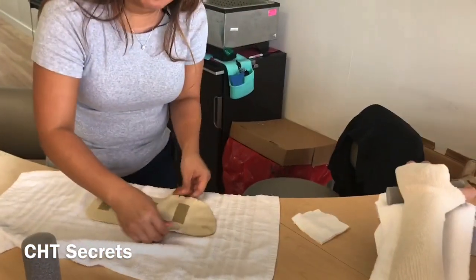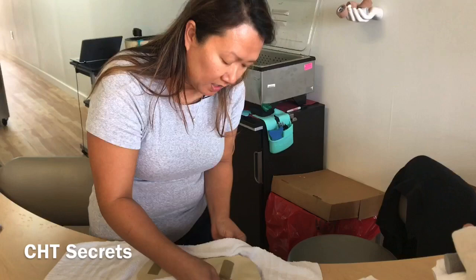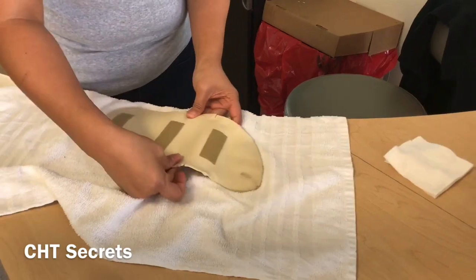This is what happens when you have to recreate a splint based off of someone else's split and the material is not your favorite. This is a really hard material and I'm trying to stretch it — it's not very stretchable. I'm using a little towel to kind of stretch it out a little bit, to give me a little bit extra room to work with this material. It's a very hard material.